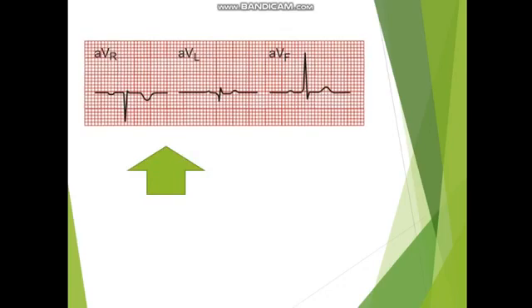Well, these are the records, and you're looking here in AVR, in AVL, and in AVF.